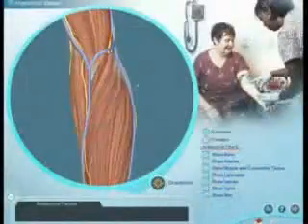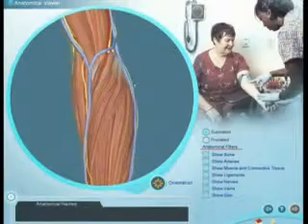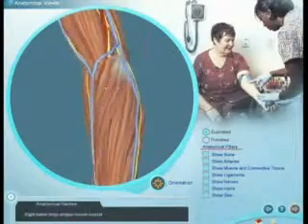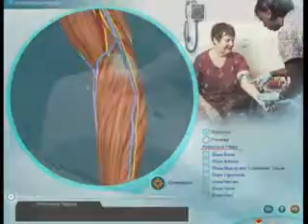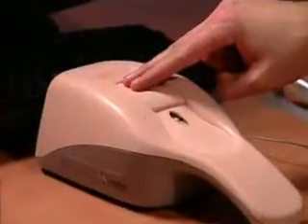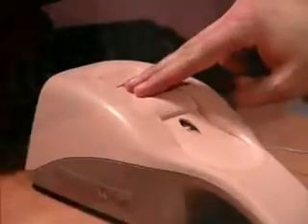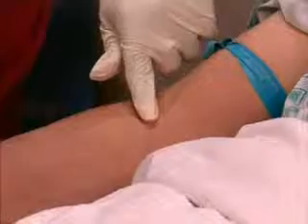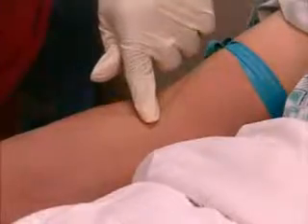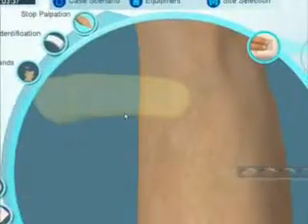Powerful 3D graphics provide visual realism, while a proprietary force feedback device accurately simulates the sense of touch for a truly immersive experience.